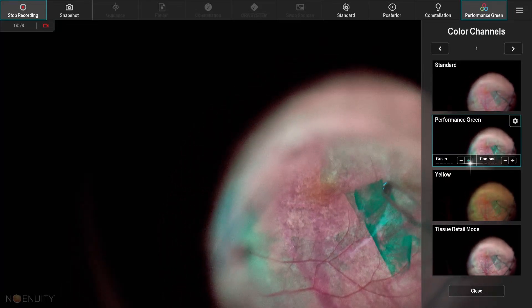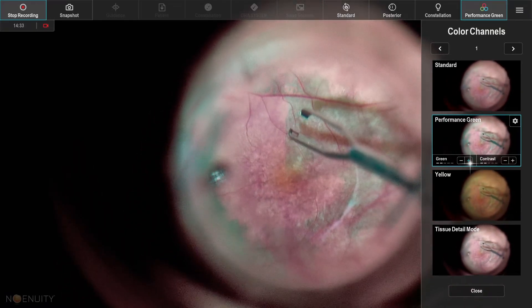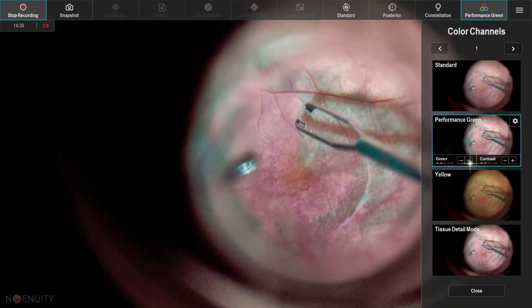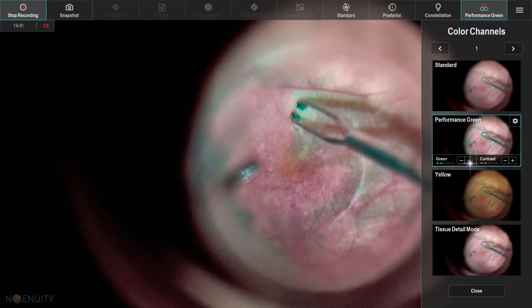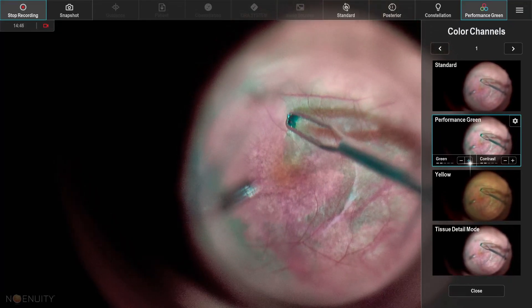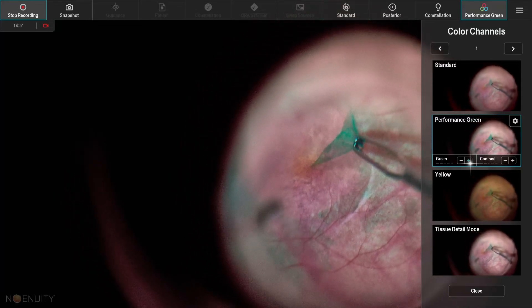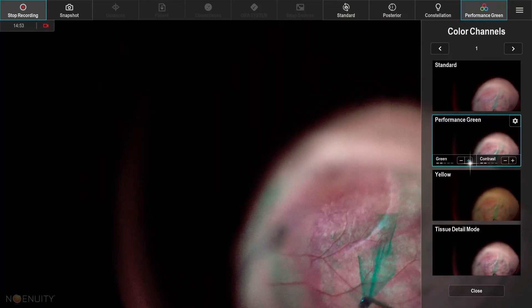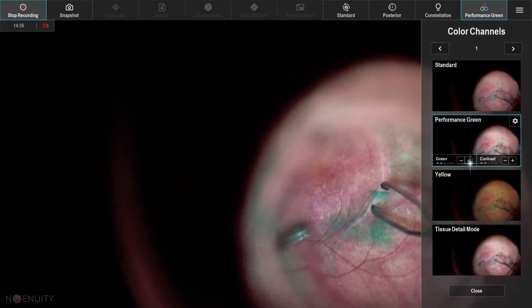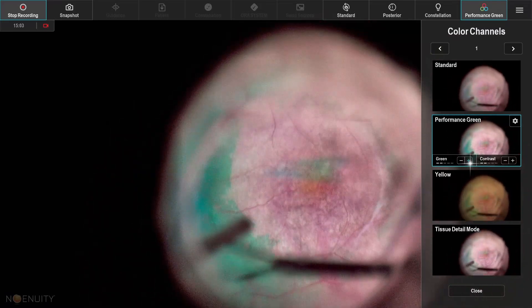I'm going to try to get this ILM up usually for about a disc diameter in all directions, sometimes a disc diameter and a half. Stay away from the fovea. I go for the place that I have the best visualization and that I feel will give me the best, most confluent peel. Just getting at the edge of that prior strip and taking care to make sure I'm not pinching too deep. Very gently maneuvering that ILM off. I like this swipe move so I don't take my forceps out of the eye — I keep my forceps in the eye, and then go back in and vitrectomize to remove the debris.